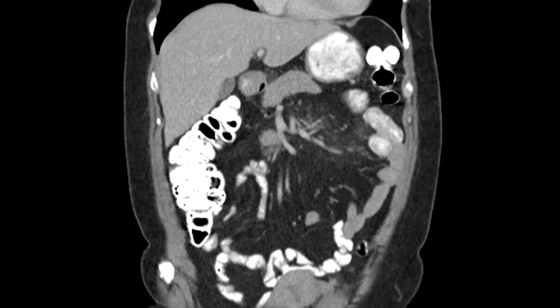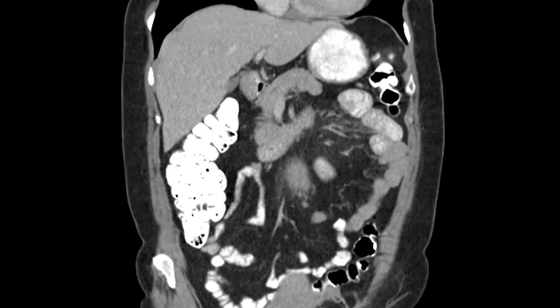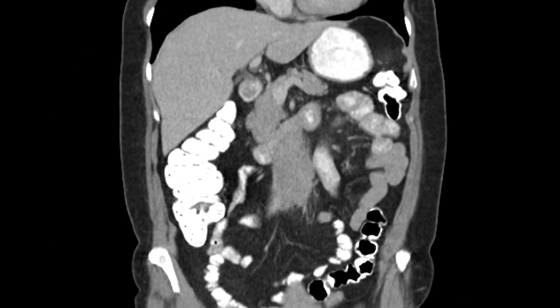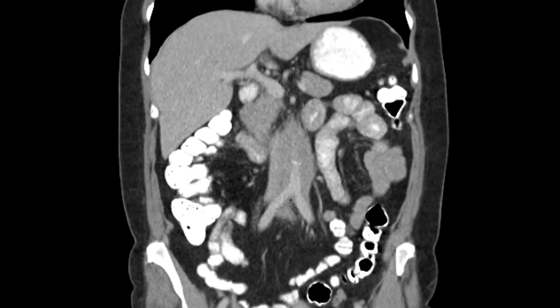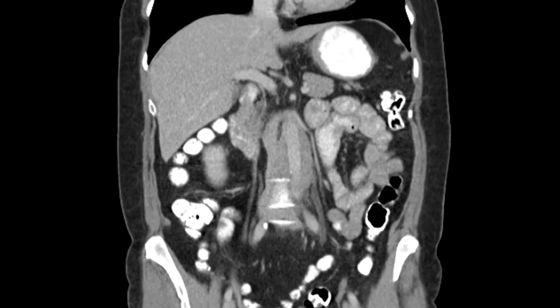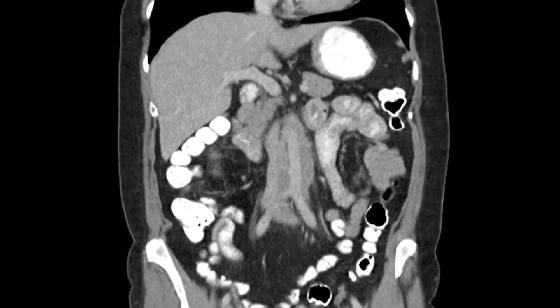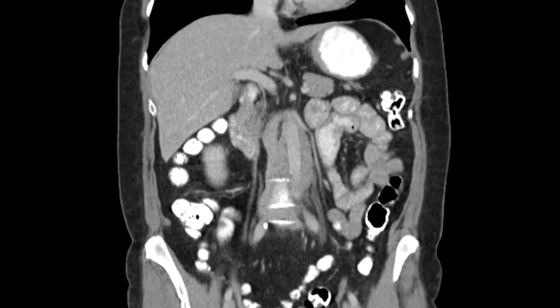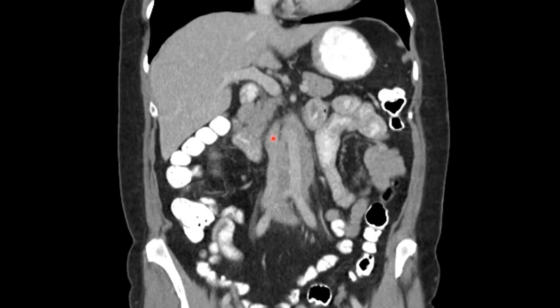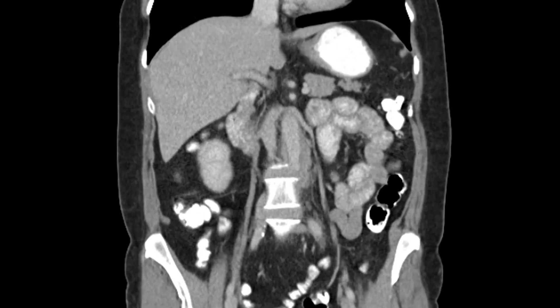Looking at the coronal imaging, here's the liver and the pancreas, and there we're seeing the superior mesenteric vein. Here we can see again that confluent hypodense soft tissue indicating retroperitoneal fibrosis about the aorta, and notice how it's partially encasing the inferior vena cava.